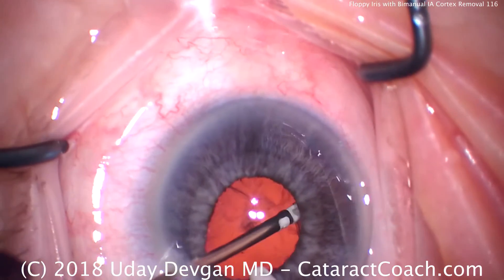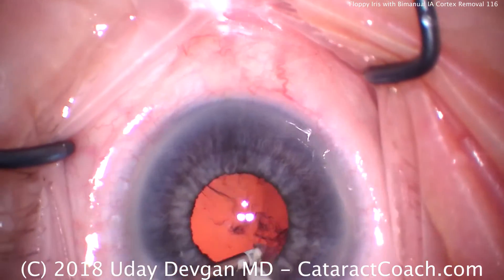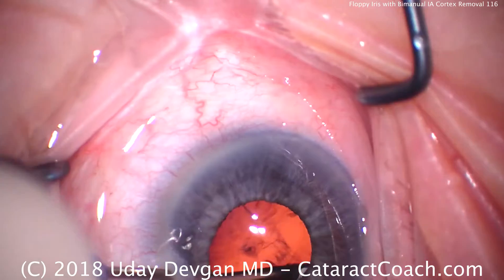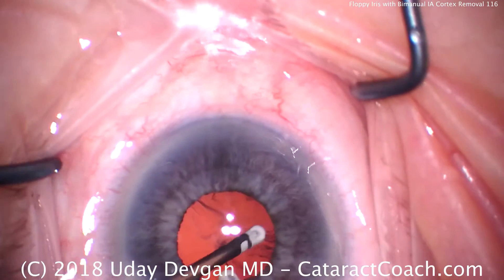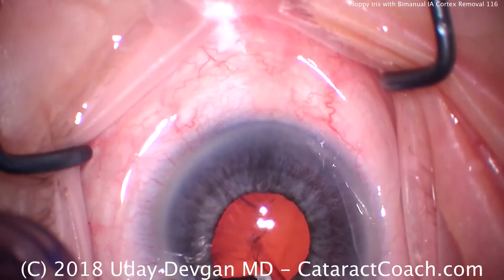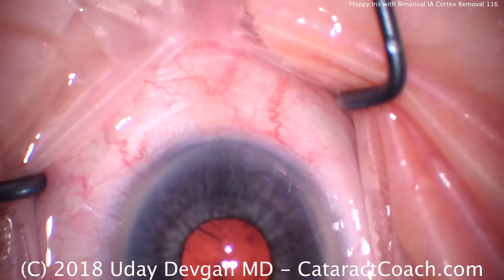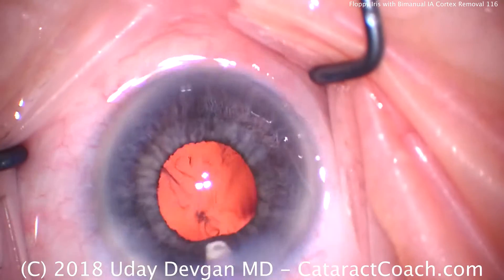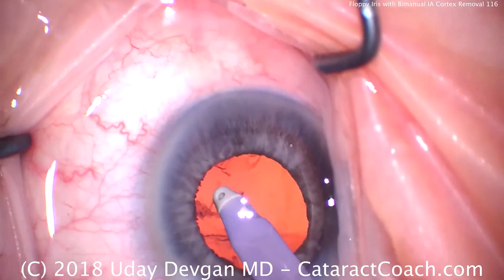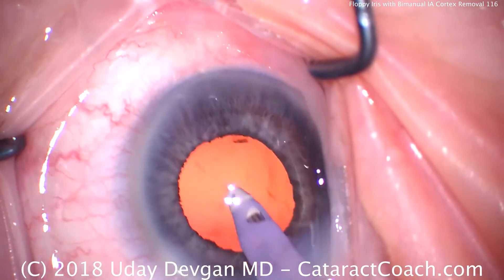Now taking our time to remove all the cortex and check very carefully. I know what you're saying — why not just put in a pupil expansion device or use some Malyugin hooks? And certainly that's a very viable option here; you've seen my recent videos where I use a pupil expansion device. But I want you to know that you can still do things without having to rely on those devices, and the teaching aspect is tremendous. This is also one of the first times we're featuring this bimanual irrigation aspiration — the bimanual transformer IA tip.